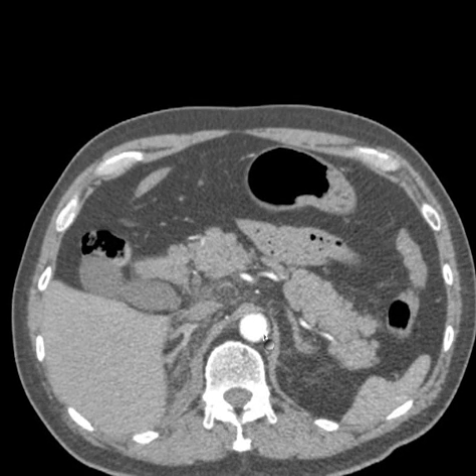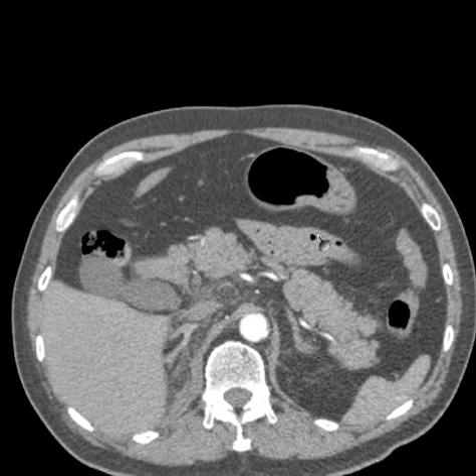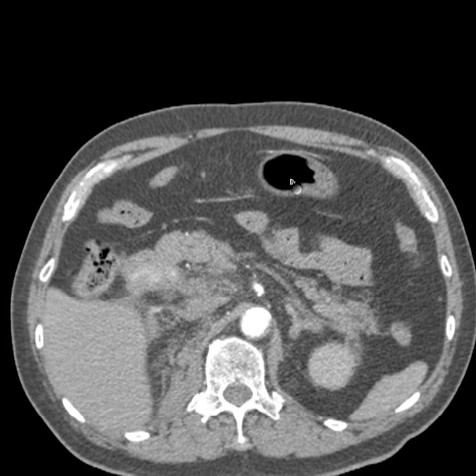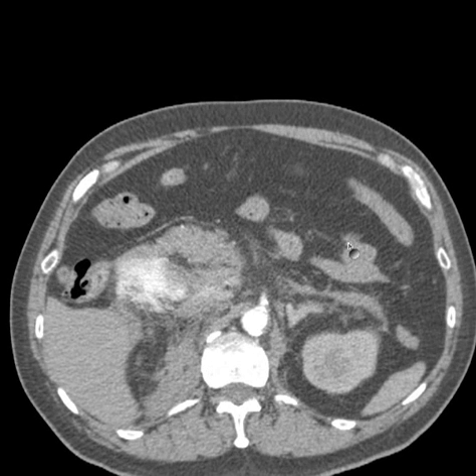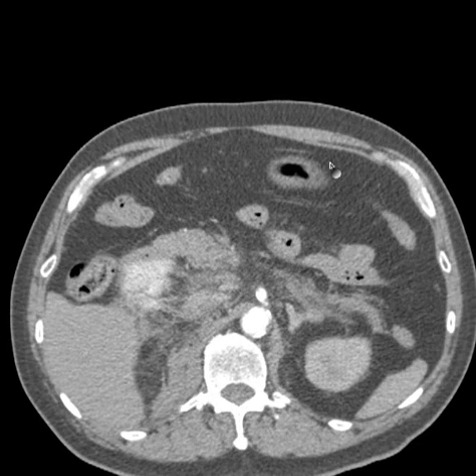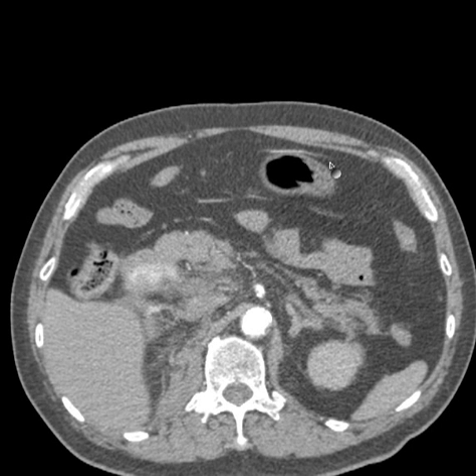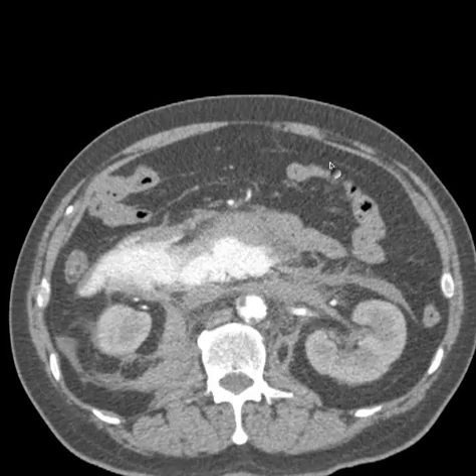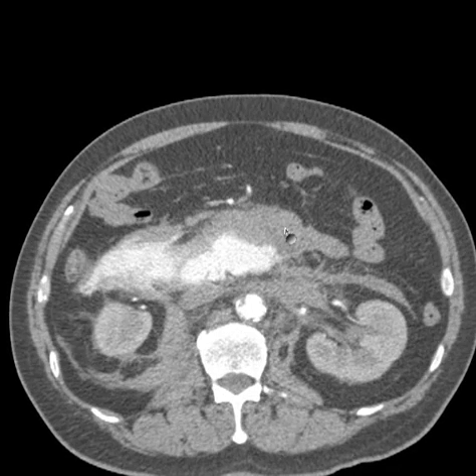There are retroperitoneal structures like the pancreas and the adrenal glands, and then there are intraperitoneal structures like bowel — portions of bowel, including most of the small bowel and the transverse colon. That means they're wrapped around with peritoneum, and that's what allows them a certain mobility in the abdomen. And as we go down here, we see this disaster.